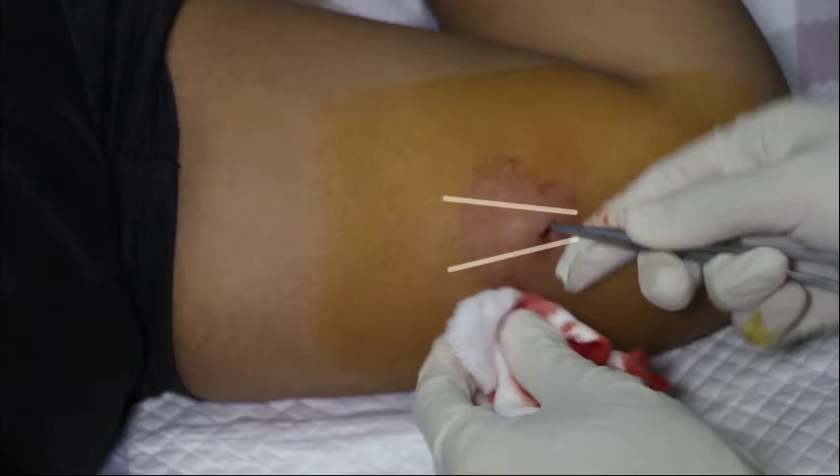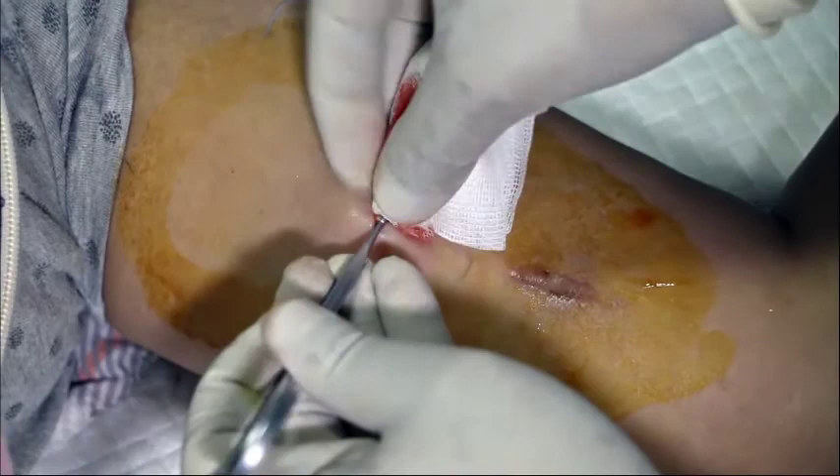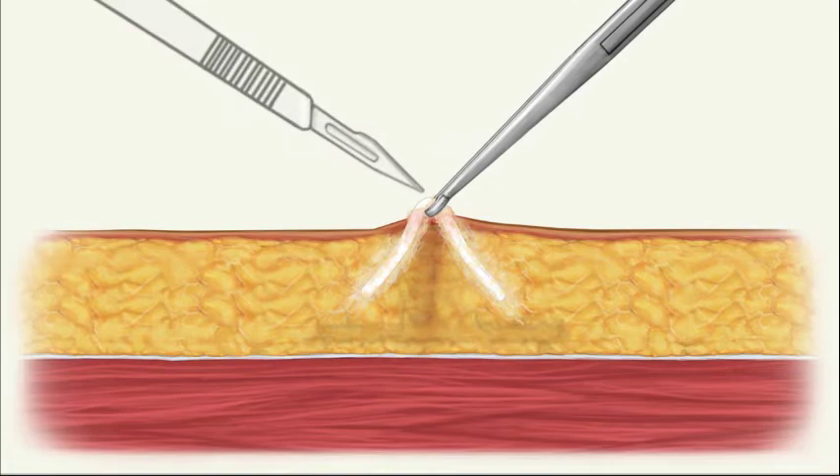Bluntly dissect off the fibrous tissue formed around the implant. Dissection may be done with gauze or by scraping the tissue with the blunt side of a scalpel blade along the length of the implant to uncover it. Pull the implant out from where it is exposed with straight or ringed forceps.